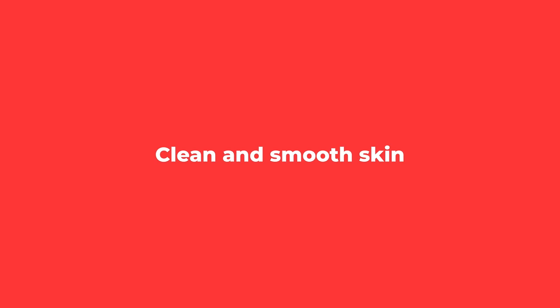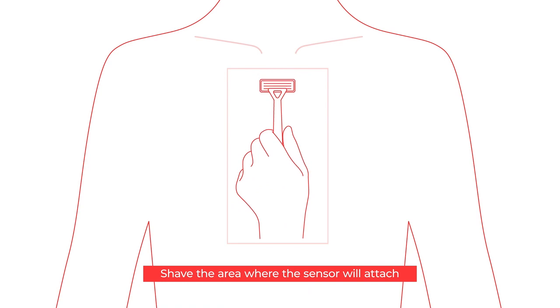You need the two parts included in the box and a regular razor. Shave the area where the sensor will attach.